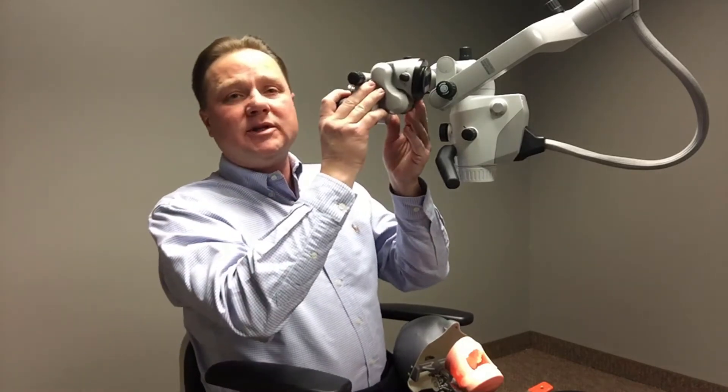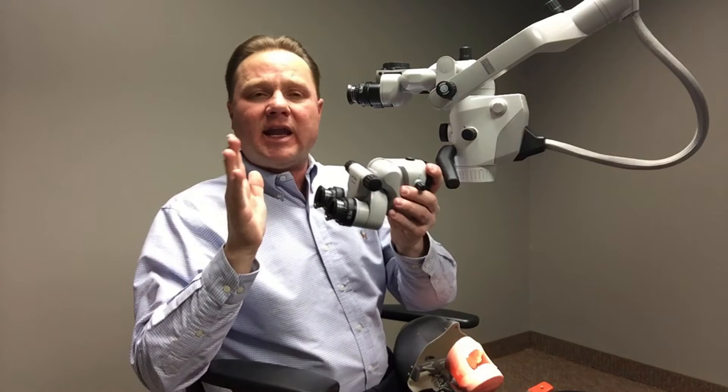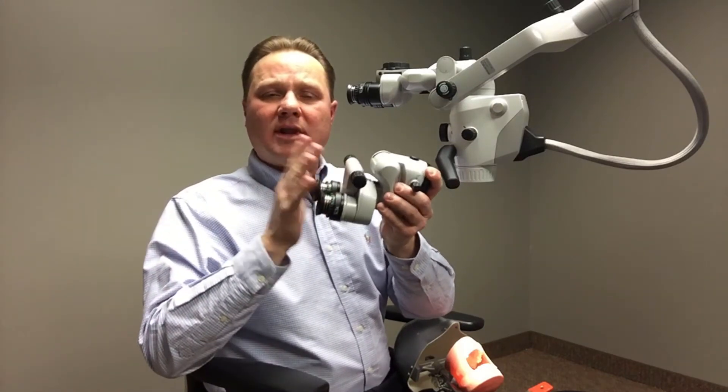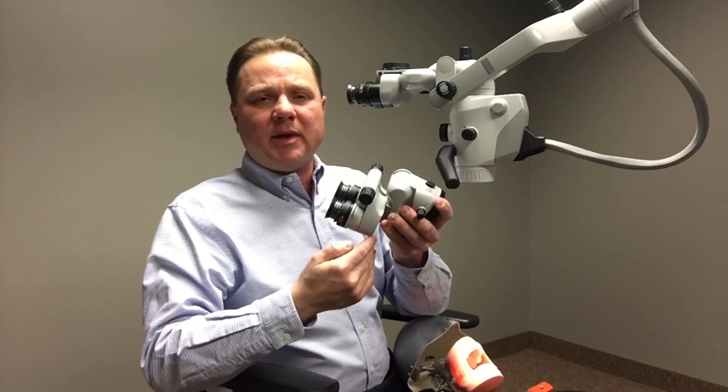The foldable tube will act like an accordion. So when this is mounted in lieu of the 180 degree binoculars, it can actually shrink down or allow the binoculars to be closer to me, and I can get closer to the patient.